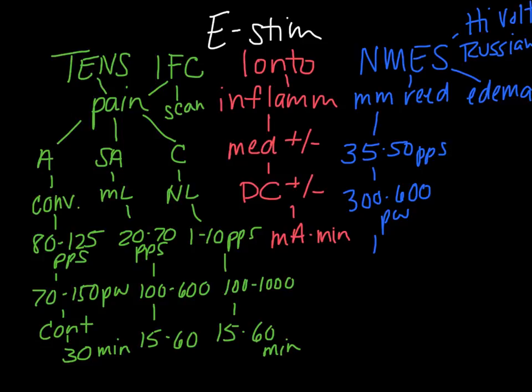You're going to set an on-off time when you're doing electrical stimulation for muscle reeducation. And there's really a range of how you may set that. Oftentimes we do a 1-to-4 ratio. So for example, you may have a 15-second contraction followed by 60 seconds of rest. But that can really vary based on your goal for the patient.